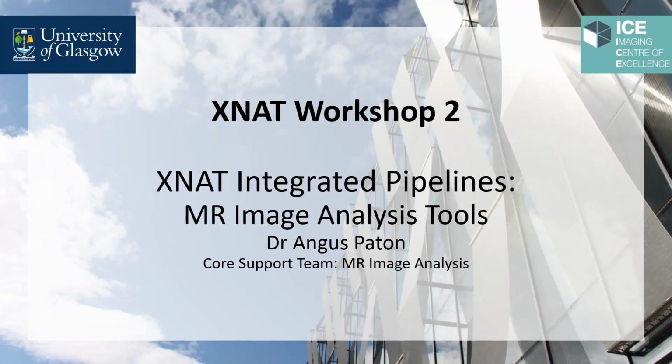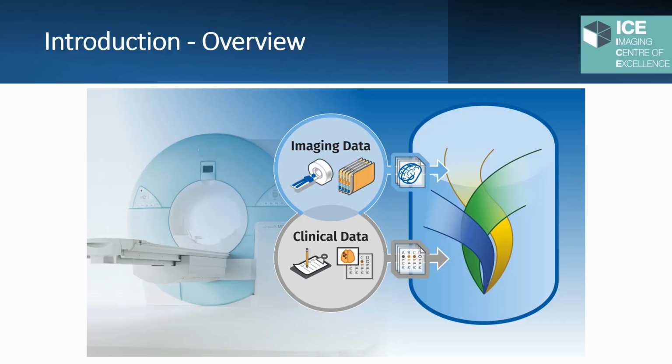This is the online recording for the second XNAT workshop, where we presented integrated pipelines for semi-automated MRI image processing on the University XNAT platform here at the Imaging Centre of Excellence. XNAT is the software we use at ICE for the purpose of storing and transferring imaging and clinical data between the university and the NHS.